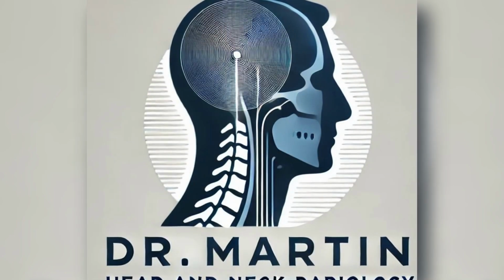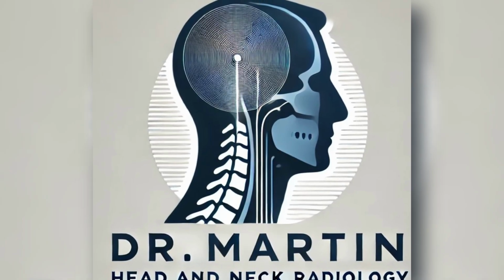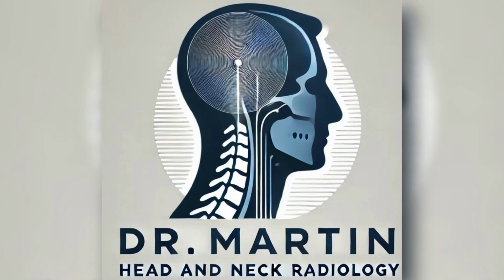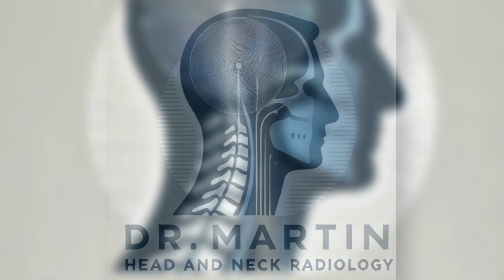In today's video, we will review the radiologic findings of the antrochoanal polyp, a benign but clinically significant entity that every radiologist and trainee should be able to recognize. The information presented is based on established radiologic literature and illustrated with a representative clinical case.